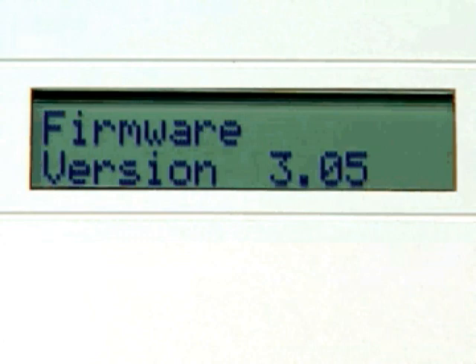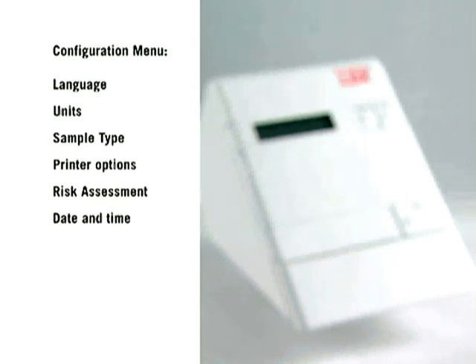The Configuration menu allows you to make changes in how the Cholestec LDX system shows information, such as language, units, sample type, printer options, risk assessment, and date and time.